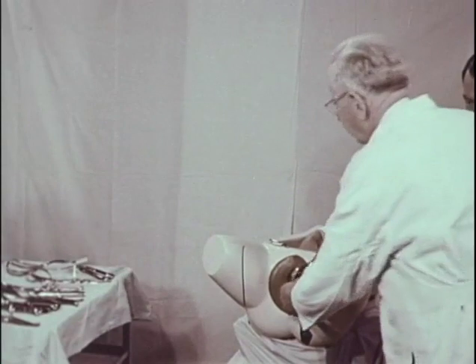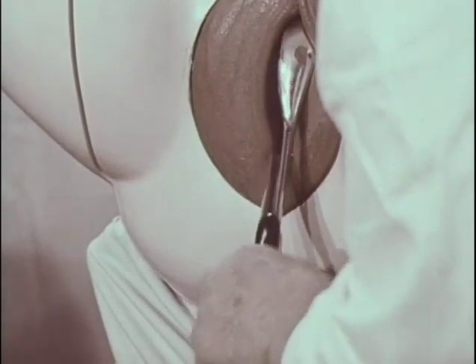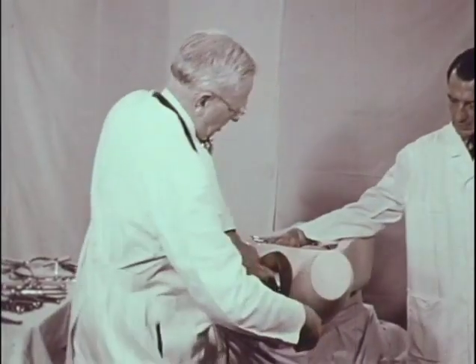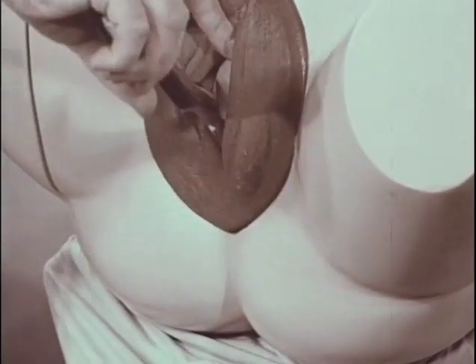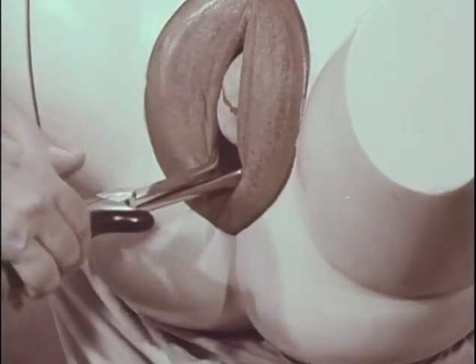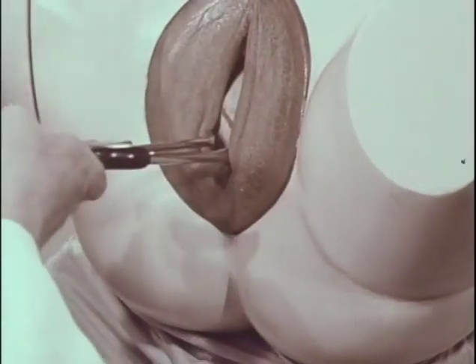And here we have that wandering maneuver, which is facilitated by the use of the Elliott type of forceps. Right under the symphysis, bring up the handle to locking position. Check our application. Rotate counterclockwise over an arc of 90 degrees, compression, flexion, rotation to anterior with depression. Check our application, make necessary readjustments, and proceed with traction.